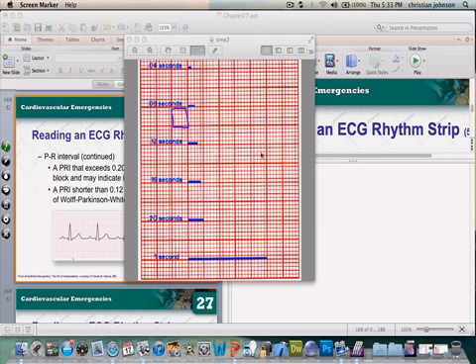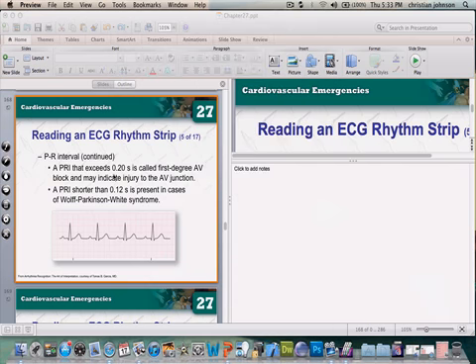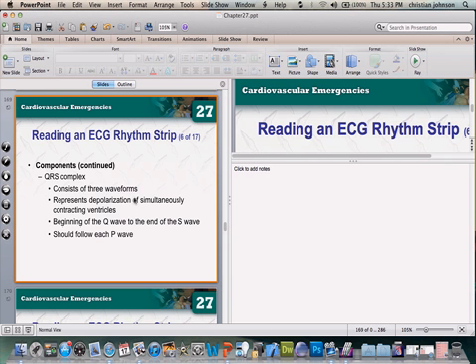Left and right on EKG represents time, as represented here. So 1 little box, we have 0.04 seconds. 2, we have 0.08. 3, we have 0.12, and on up. So that's our EKG paper with the big boxes and the small boxes. We want to make sure that when we measure our PRI, it's between 0.12 and 0.20. Conditions like Wolff-Parkinson-White and LGL are conduction defects that we're going to go over at another time.